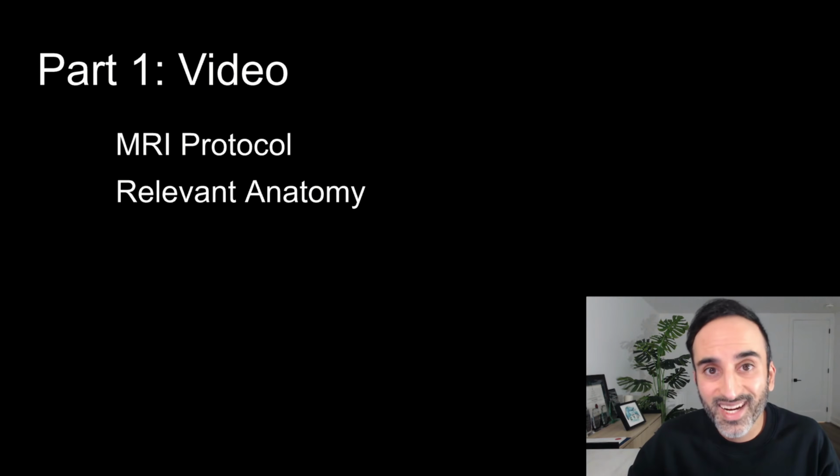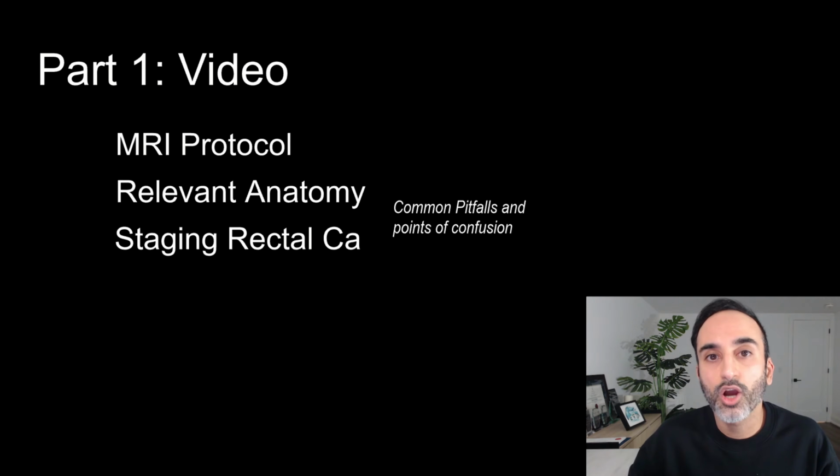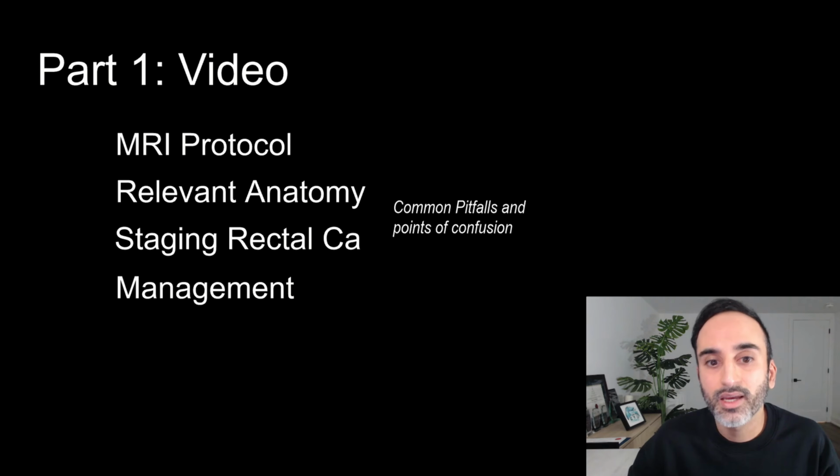The structure of the course is as follows. So this video will cover introductory material, including the protocol, relevant anatomy, and how to stage rectal cancers with a focus on common pitfalls and common points of confusion. We'll also talk about why staging matters, i.e. how it affects management and prognosis.